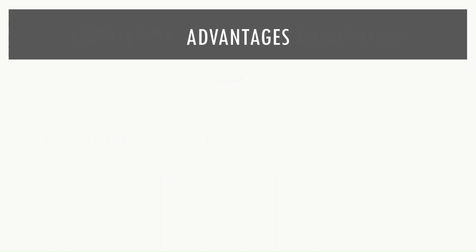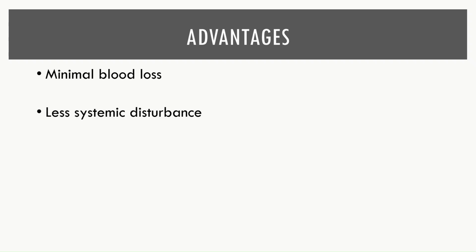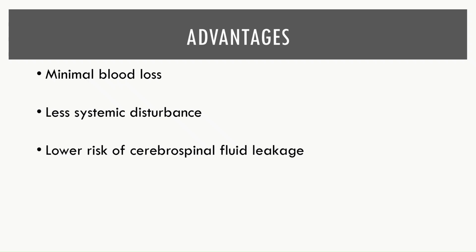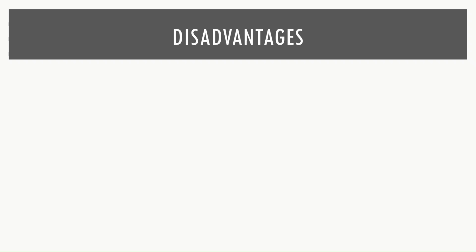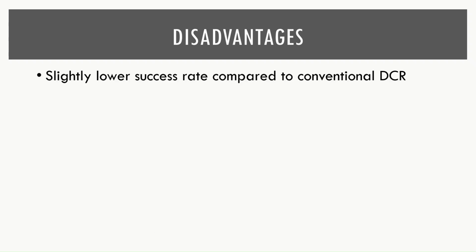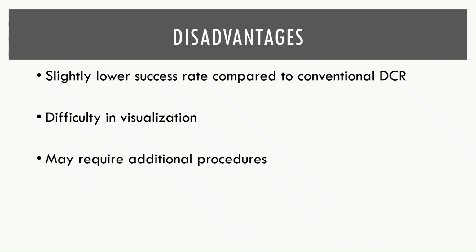The advantages of an endoscopic DCR include minimal blood loss, less systemic disturbance, lower risk of CSF leakage, no skin incision, and shorter operating time. Disadvantages include generally a slightly lower success rate and visualization difficulties, meaning that additional procedures are sometimes needed.